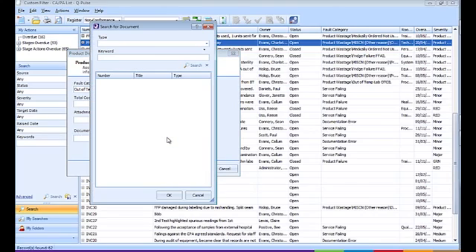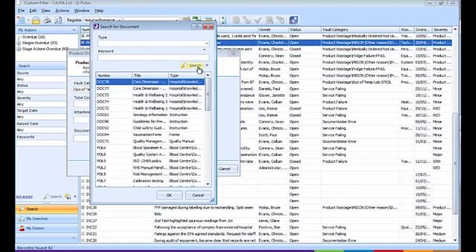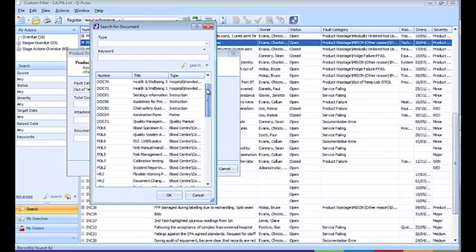We have the ability to cross-reference documents stored within qPulse in a controlled manner. This could relate to the product discard procedure and also the product handling procedure. This information will assist with the investigation.